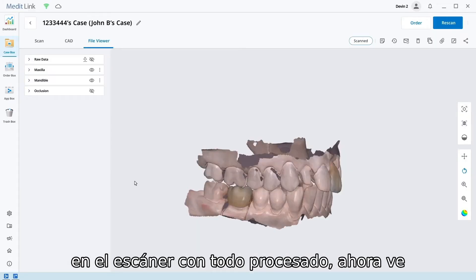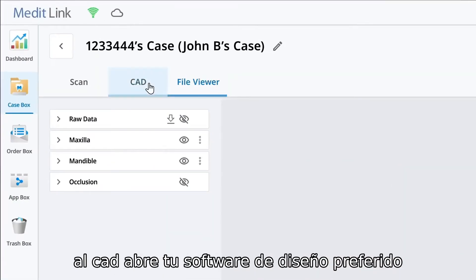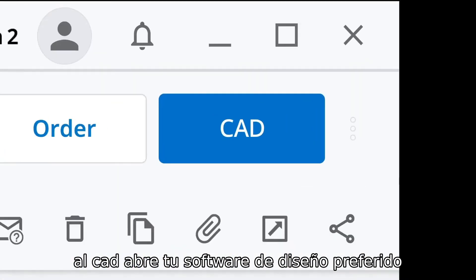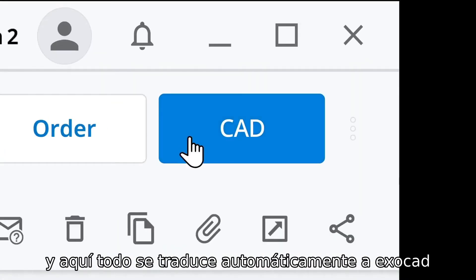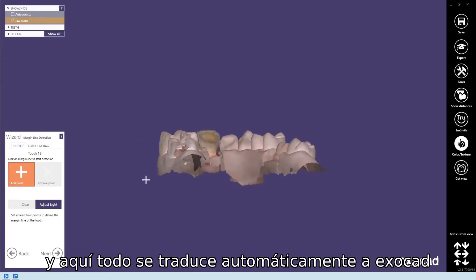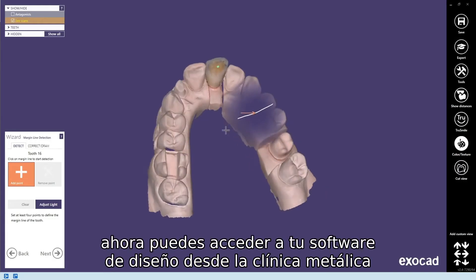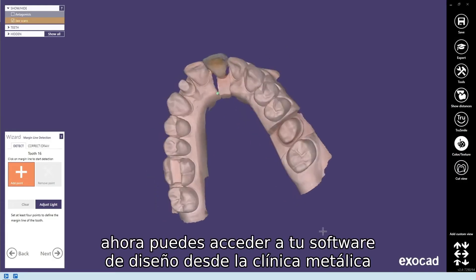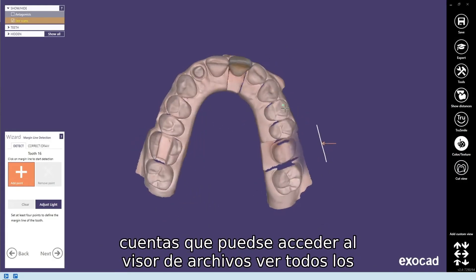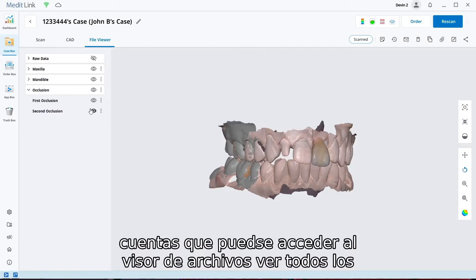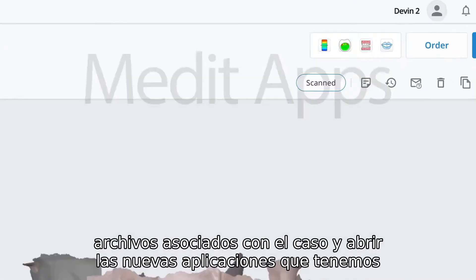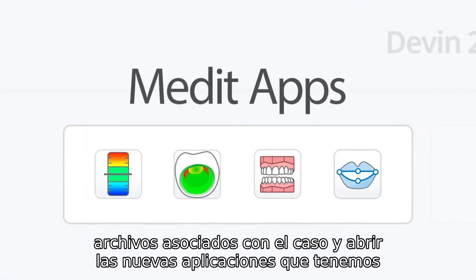With everything processed, you now go into CAD, open up your preferred design software, and everything is automatically translated into ExoCAD. You can access your design software from the MeditLink clinic accounts. You can go into file viewer, view all the files associated with the case, and open up the new applications.